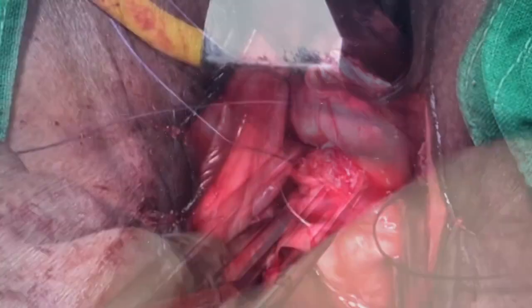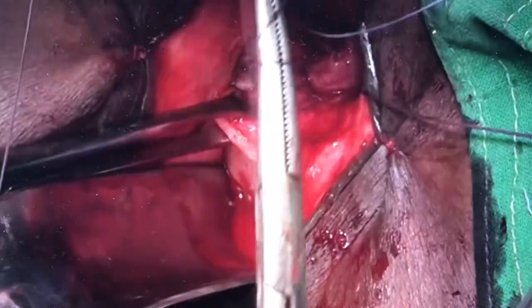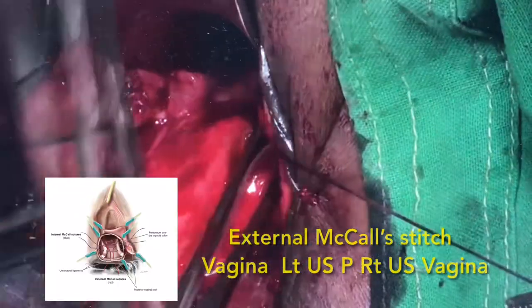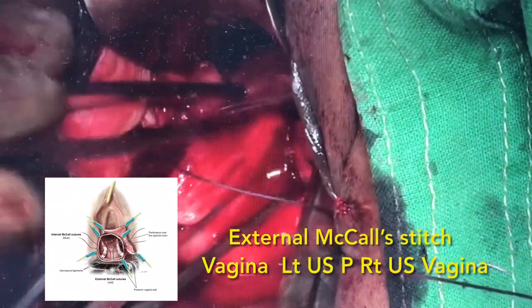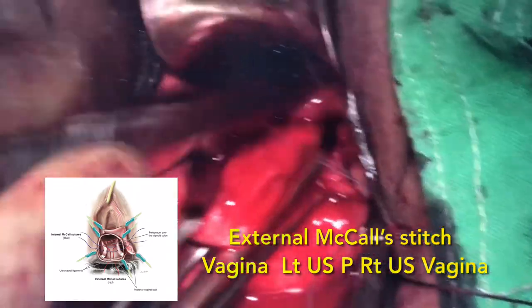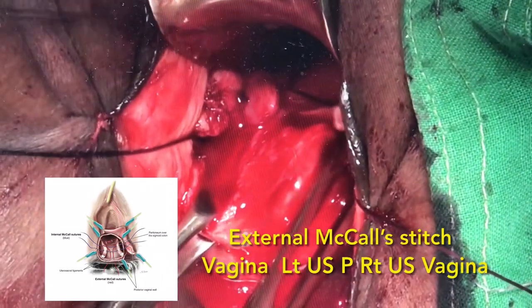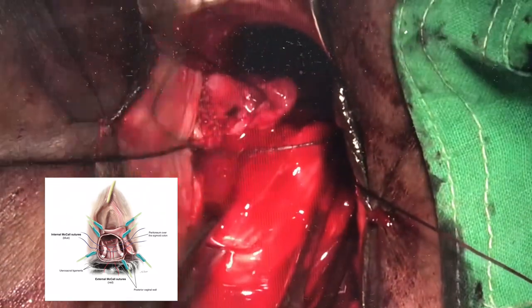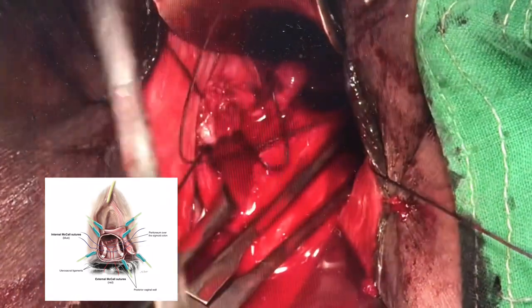We always believe in peritoneization. At the same time, we do high ligation of the posterior pouch — it is like a Moscowitz done from below and it prevents recurrence in the form of an enterocele. We believe in taking an external McCall suture wherein we go from the vaginal wall, the left uterosacral, the peritoneum, the right uterosacral, and the right angle of the vaginal wall. This external McCall stitch is taken with number 1 Vicryl, comes out to the vagina, and will be tied at the end of surgery.